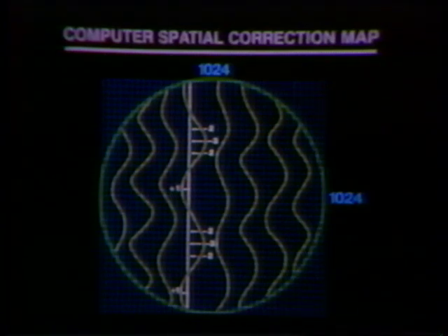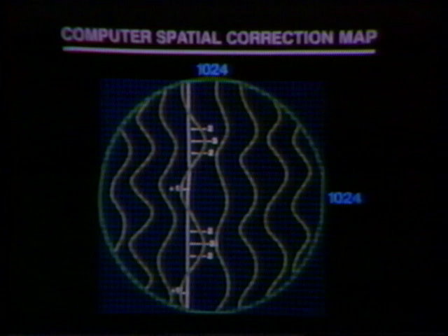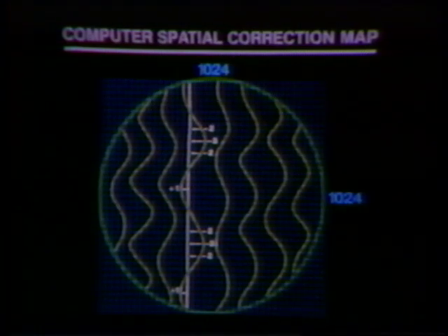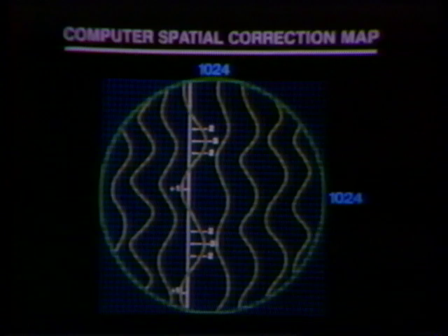Then, when the camera is used for imaging, as each event strikes the crystal, X and Y positional signals are sent to the spatial correction circuits, where appropriate corrections are applied depending upon where the event occurred in the crystal. This procedure is called nonlinearity correction, or spatial distortion correction.